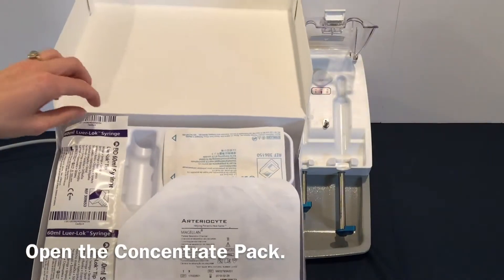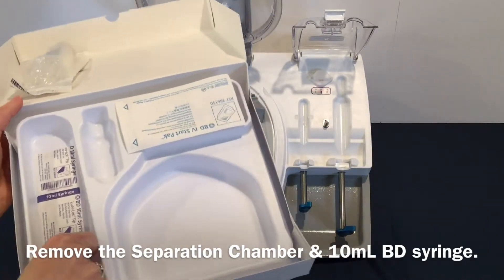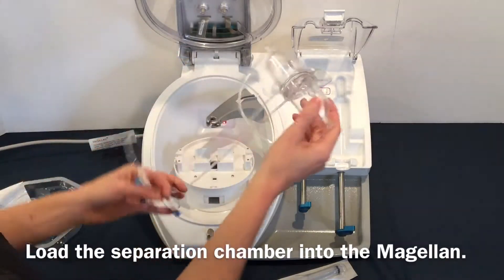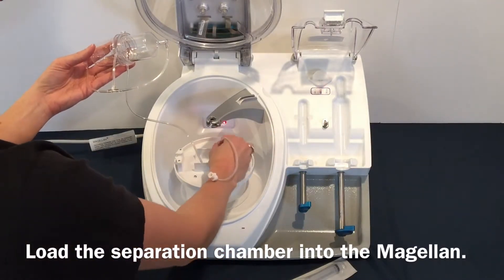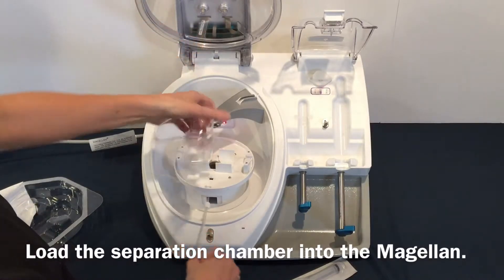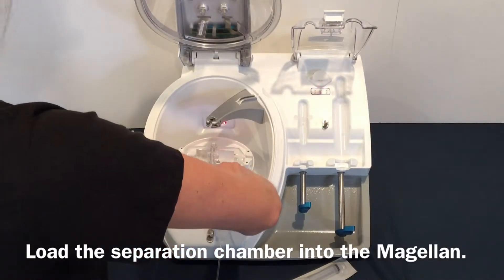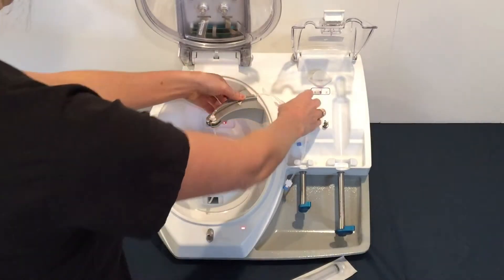Open the concentrate pack. Remove the separation chamber and a 10 mL BD syringe. Set the 10 mL syringe aside and open the separation chamber. Load the separation chamber into the Magellan. Close door 1.